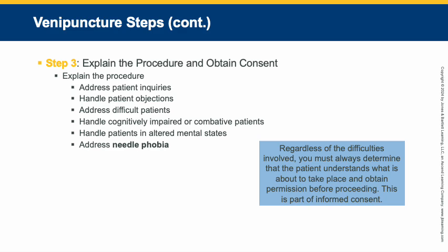Okay, step 3, explain the procedure and obtain consent. You're going to address the patient's inquiries, like anything that they may have a question about, and handle any patient objections. You are going to address difficult patients. Sometimes they may be stressed out, they may be lonely, they may be scared, they may be just plain disagreeable, because it happens. It's important for you to remain calm and professional in this situation and treat the patient in a very caring manner, no matter how that patient is responding.